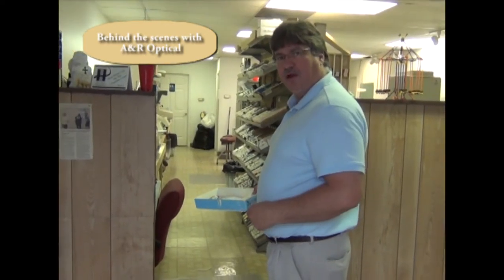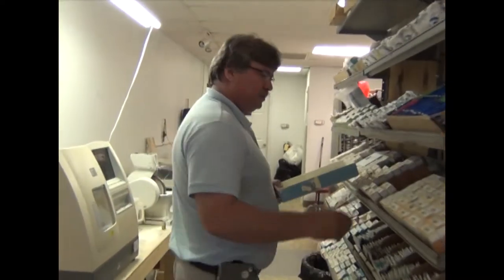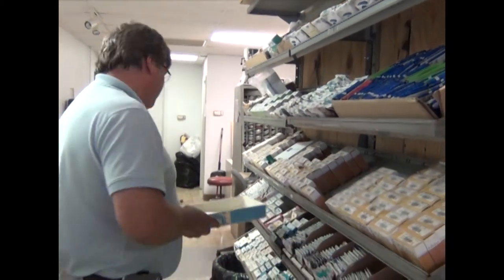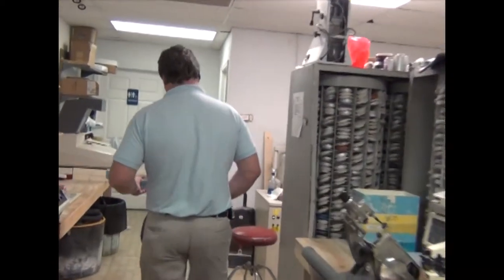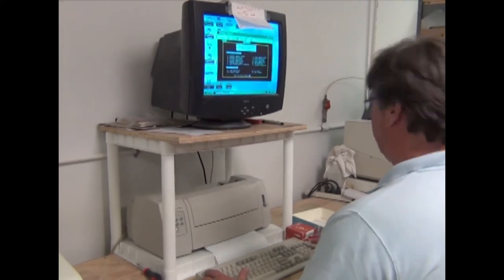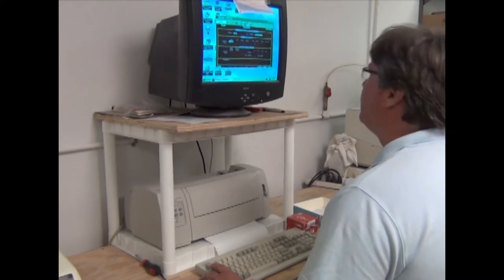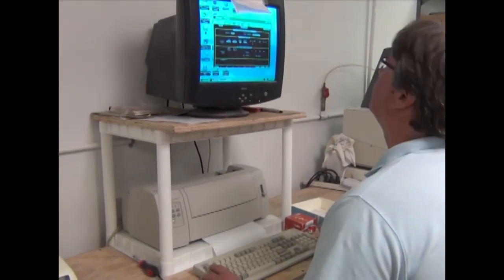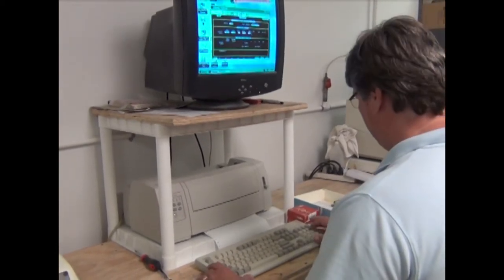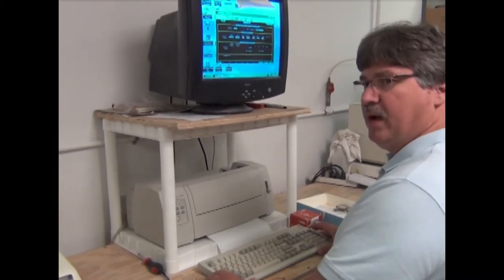Come on in and I'll show you the inner workings of A&R Optical. We'll stop right here and pull a couple lenses to block up. Stop right here with the computer. I'm putting in the prescription into the computer right now so that it will manufacture the tools that we need. This is the new way of doing it.